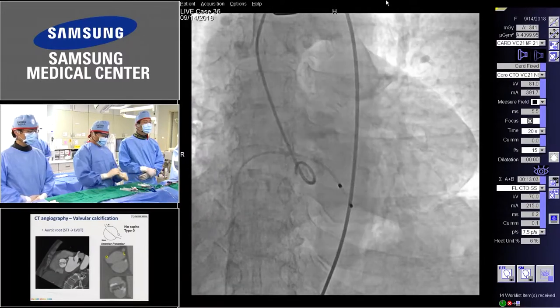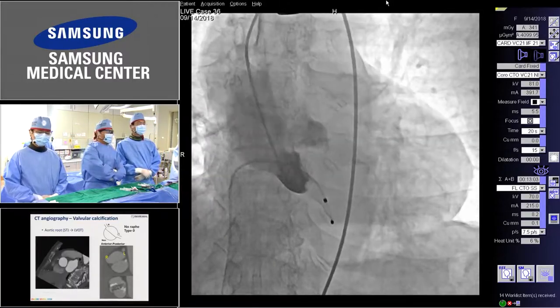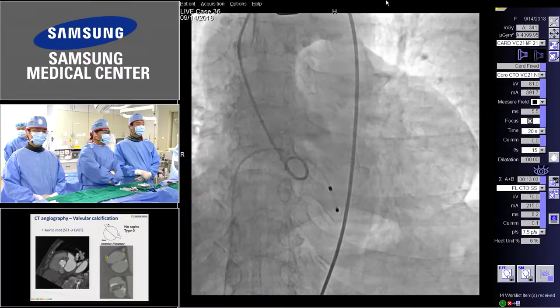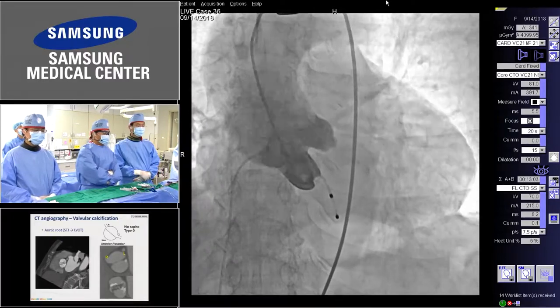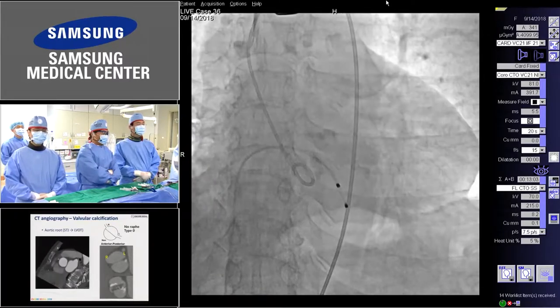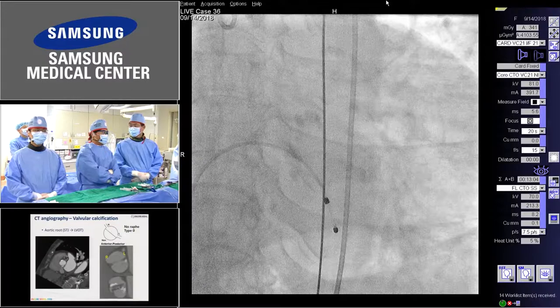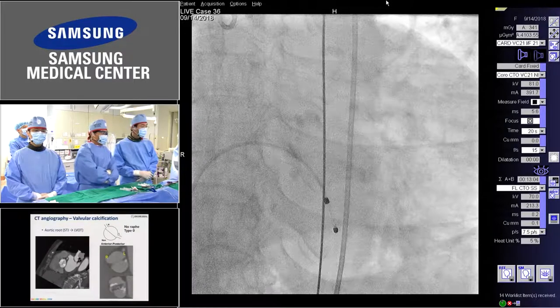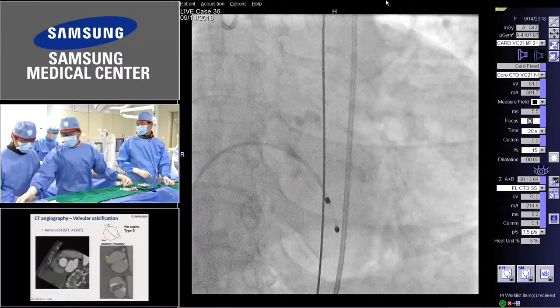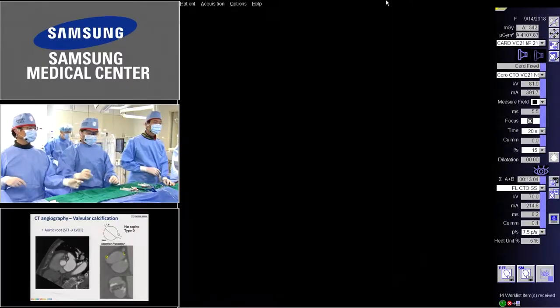I think right now there is no specialist, because we are learning a lot about bicuspid valves, and to be quite honest, we have a lot of diverging opinions about this. I don't know who's right or who is maybe not so right. Being a little bit more in China these days, we learn a lot about bicuspid valves with heavy calcifications. As you know, Hangzhou does this stepwise ballooning with balloon sizing in order to find the right valve size. Me personally, I believe we have to understand that the anchoring structure in bicuspid aortic stenosis is not the annulus, it's actually the leaflets.